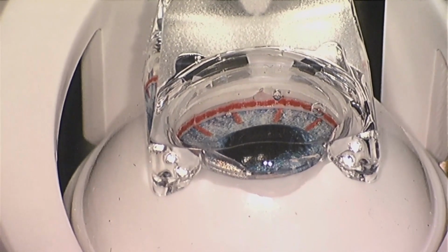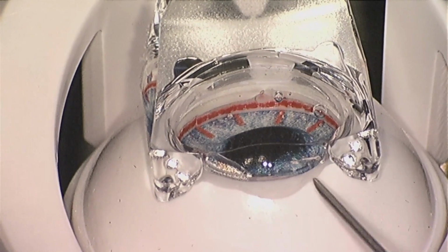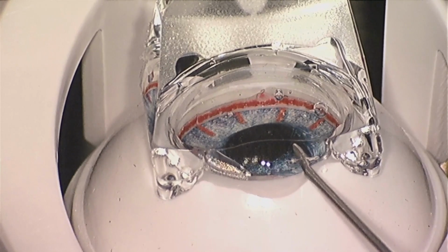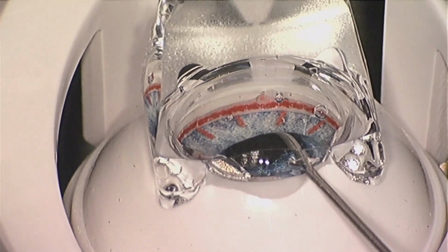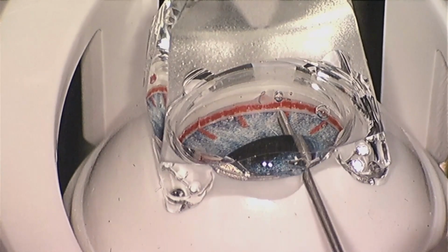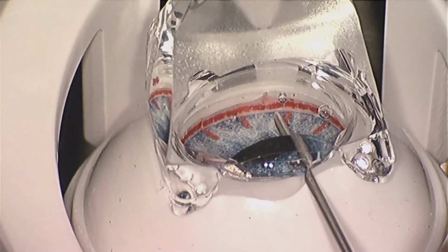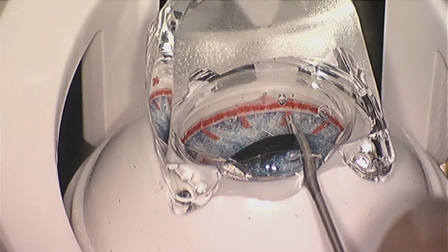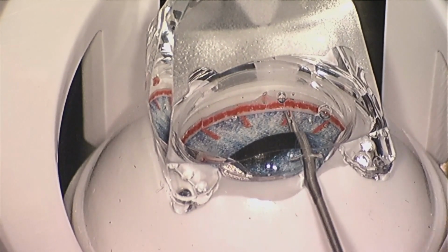Okay, now you can see that we're in the wet lab here, and I just need to lift my left hand to lift the gonio prism just a little bit, and you can see with my right hand I just gently wiggle in my incision to get the device in proper position. Again, you can see that protective sleeve over the trocars. I like to get that in good focus and in proper position, and then I'll just gently slide the sleeve back to expose the trocar.